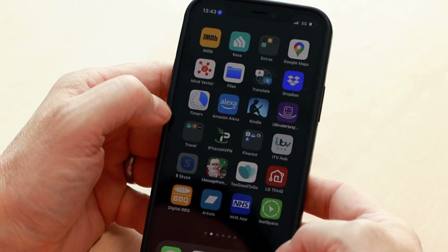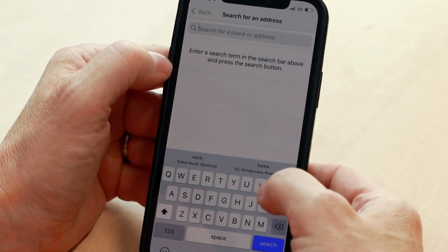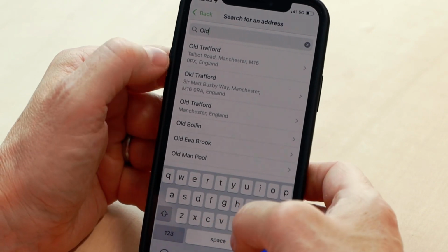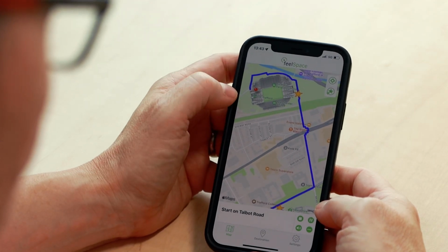So there's a couple of ways this works. One of the ways is via a turn-by-turn routing scenario, which is basically using Apple Maps. So on the app, you tell it where you want to go, and then it'll work the route out, and it'll tell you literally left and right. It does that through this vibration, but if you want, you can also listen to it and have an audio update. But the whole point of this really is to do it tactilely and not have that audio disruption.